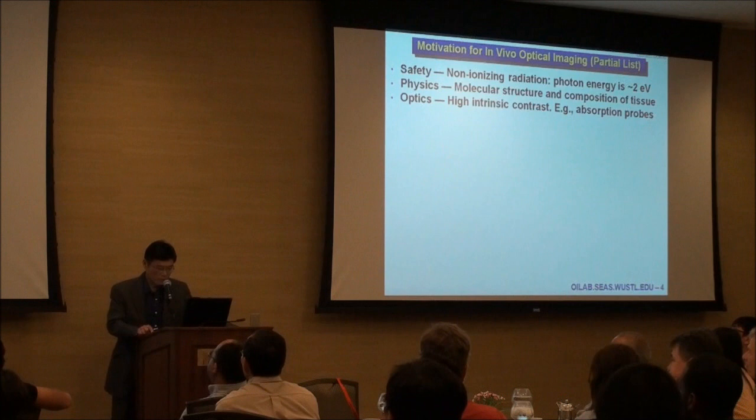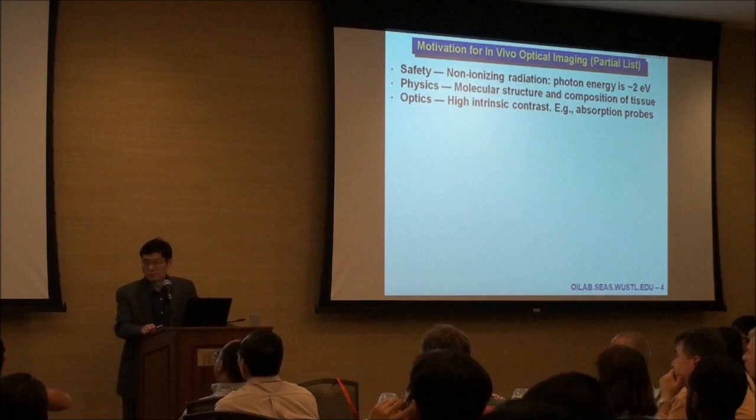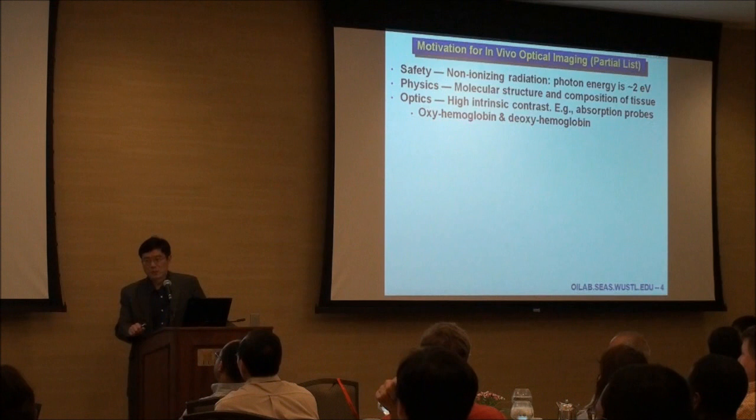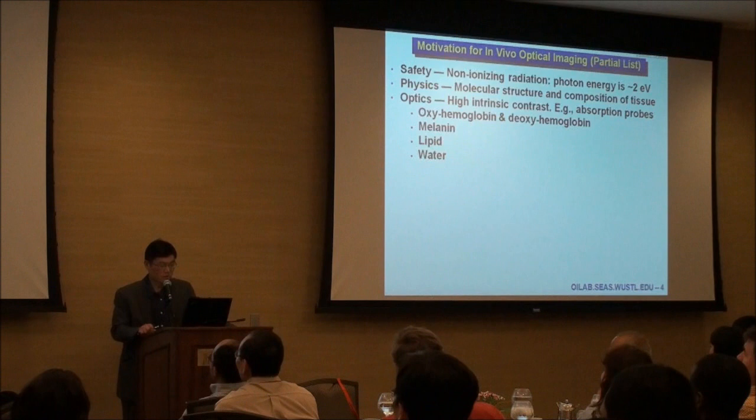In optics, we talk about various optical properties: scattering, absorption, fluorescence, and whatnot. And today I'll focus on absorption because photoacoustics is most sensitive to absorption. Optical absorption allows you to probe all sorts of biomolecules such as oxyhemoglobin, deoxyhemoglobin, melanin, lipid, even water. When you use the right wavelength, you can image water as well. And DNA and RNA.